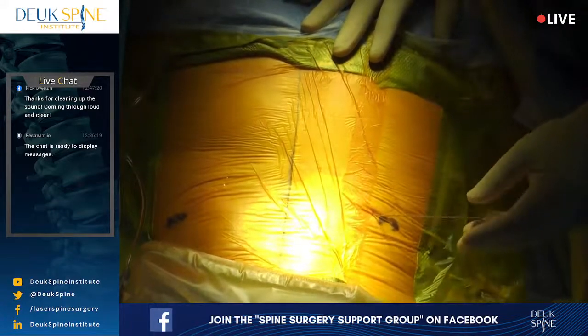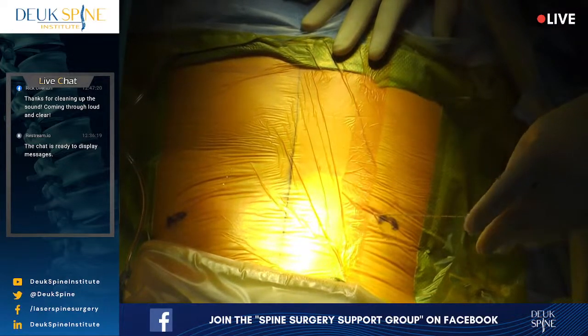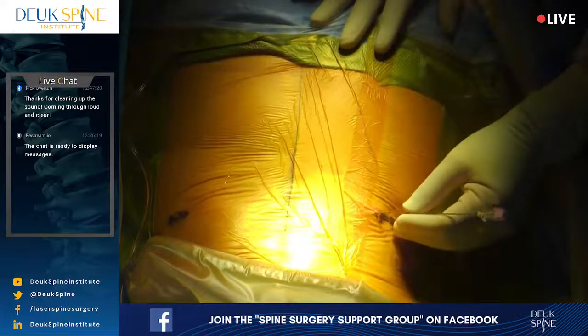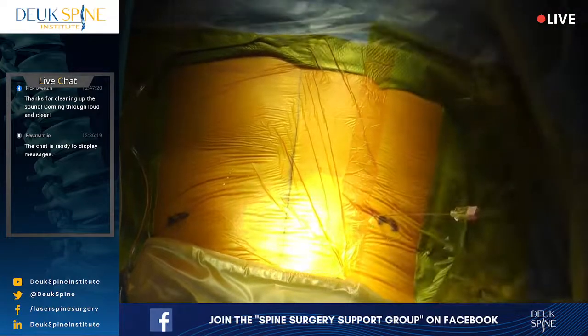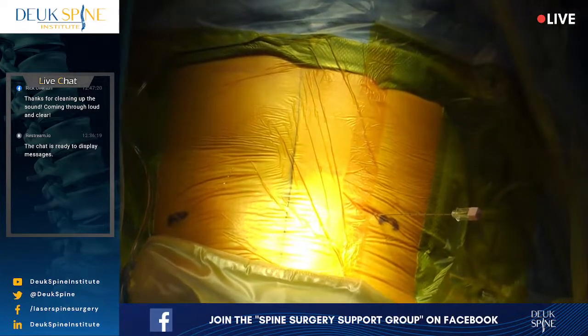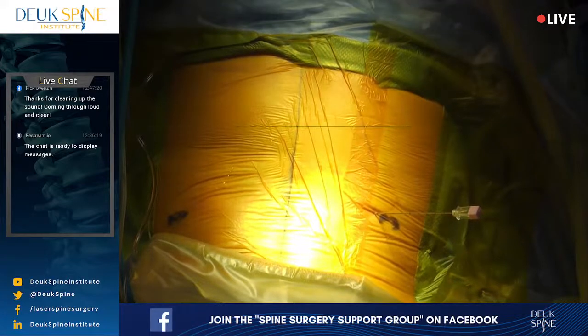All right, let me know if it's uncomfortable, okay? Just say ouch, and then I'll give you more numbing medicine. All right, I apologize that we need you awake in the beginning. So I'm going to go for L3-4. Let's go south a little bit with the fluoro. Beautiful job, Jordan, of identifying that. I wouldn't go too far, just a little bit, just half an inch.